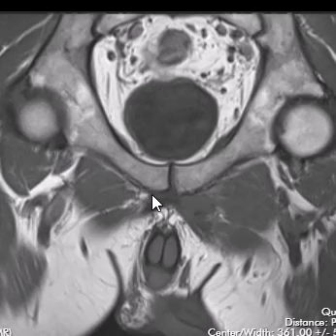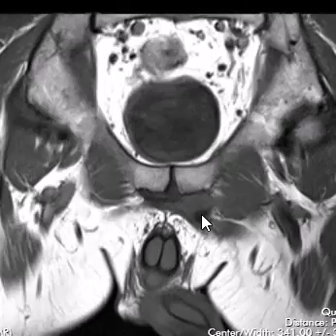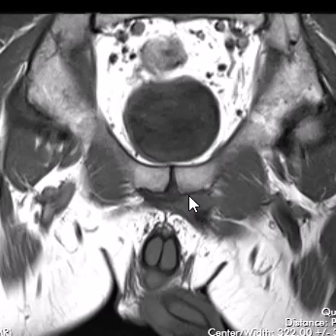This is the adductor longus tendon coming up and attaching to the aponeurotic attachment. Over on the other side, we don't see that nice darkness — we see gray instead. This is an abnormality. This is the adductor longus that stops right here, and there's a gap. It's been pulled right off and down.